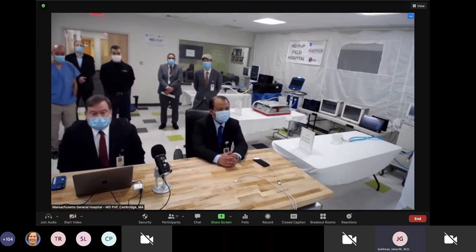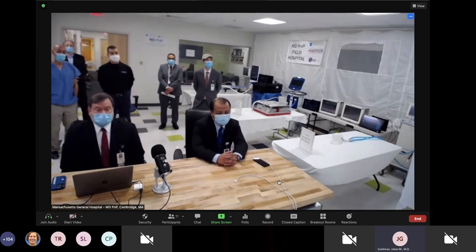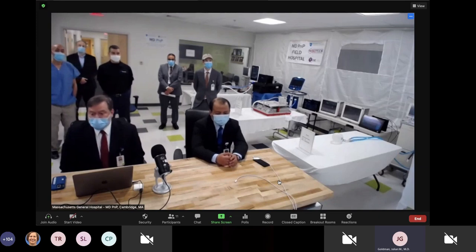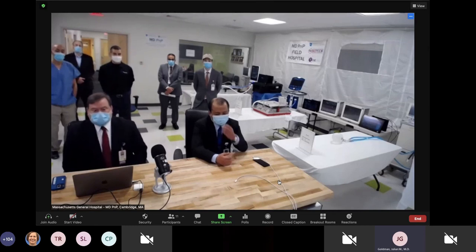So, we showed capabilities today. Of course, everything was real, we didn't fake anything, but the maturity level of the technologies was quite different across the board. There's availability today of remote data access and remote data viewing. The remote control was really working, but the products are not necessarily on the market because there's more work to be done in those areas, cybersecurity and risk management and so forth. But some of them are and have been. For example, the Nihon Kohden product with the cable-based control is available and is being used to good effect.